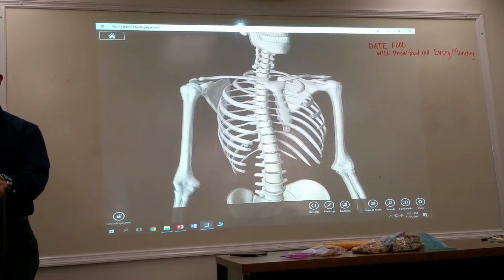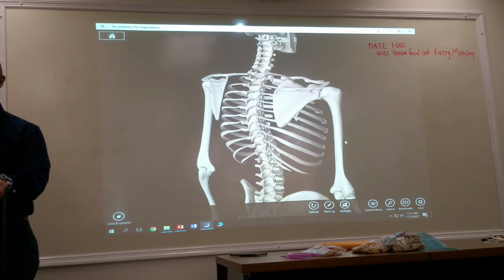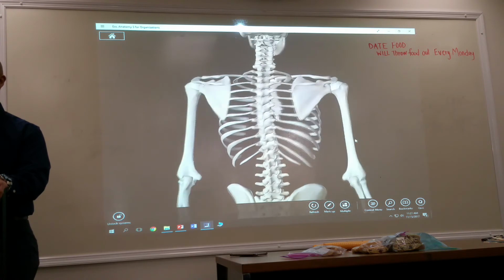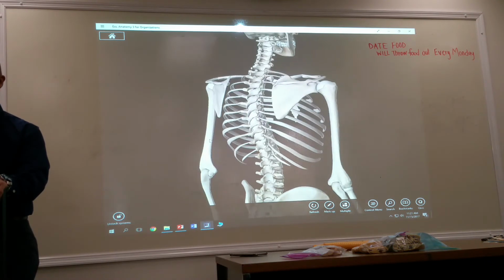So now I'm going to flip my patient over and place them in an LPO position. Look what happens. In an LPO, it's the side down, the side closest. See how this gets elongated and this gets foreshortened? So this is your LPO, and this is your RPO to look at the right. It's the mirror.